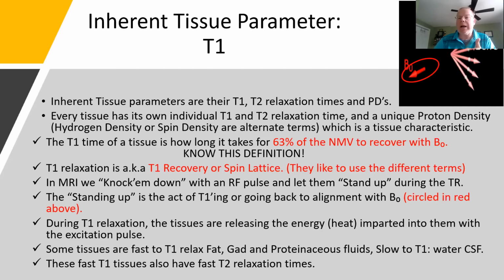Know that water has a long T1 and a long T2, as opposed to fat, which has a short T1 and T2. So fat, GAD, and proteins are fast to T1, and water and edema are slow to T1.